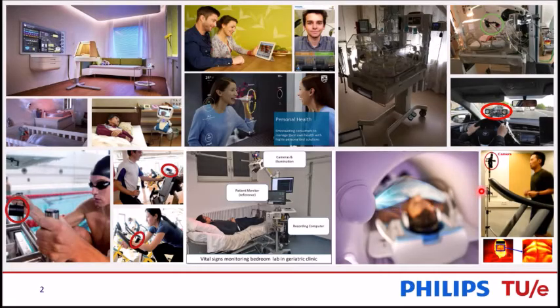The camera can be used as a sensor to measure vital signs and body signs from human subjects, such as heart rate, respiration rate, SpO2, emotions, activities. This information can be related to the health state of a person. And this camera technology has been used in various applications, such as in hospital care units, home-based monitoring, elderly care, baby care, fitness, automotive, for health monitoring. And especially now, due to the outbreak of the coronavirus, contactless health monitoring is even more desired.